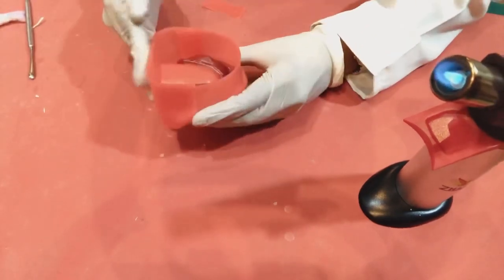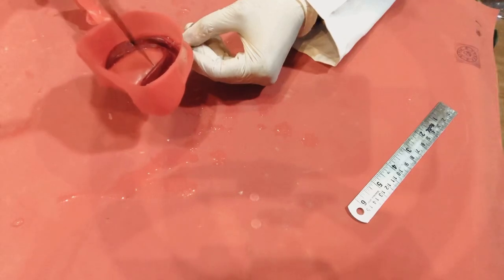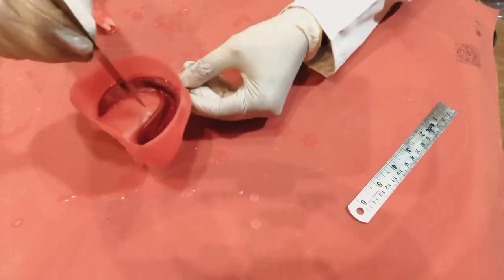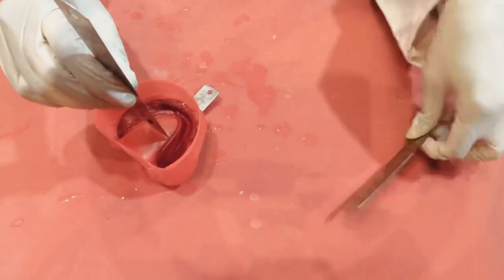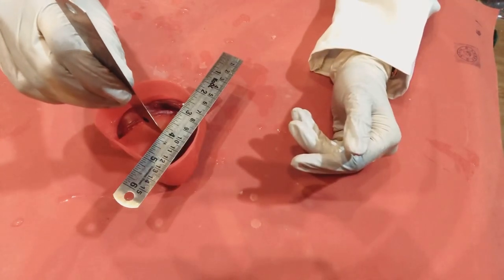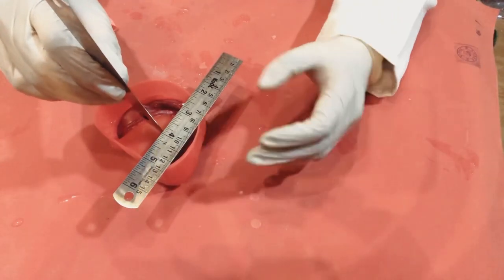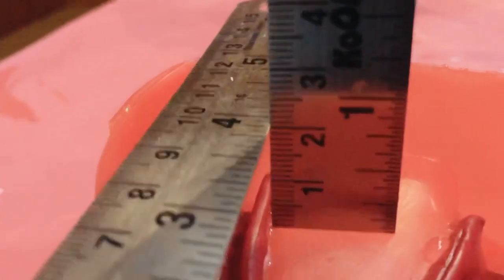Place another wax sheet posteriorly to complete the boxing. Make sure you have adequate height of boxing. Thickness of base of the cast should be 13 to 15 millimeters from its deepest point, so check it from the highest point on the lingual border. As mentioned earlier, think in reverse. Deepest point on the cast corresponds to the highest point on the impression.